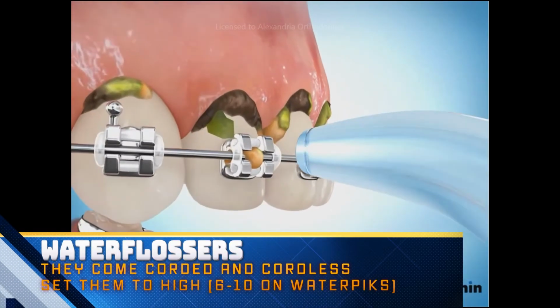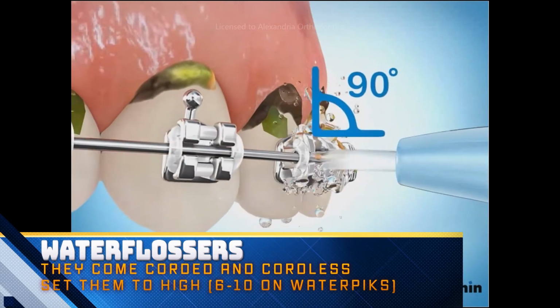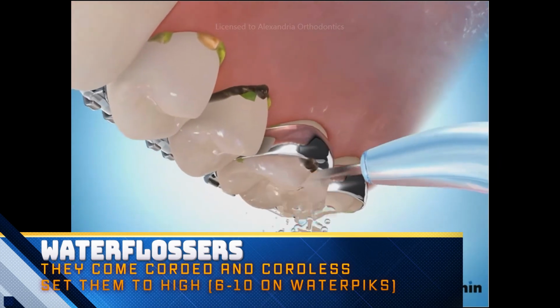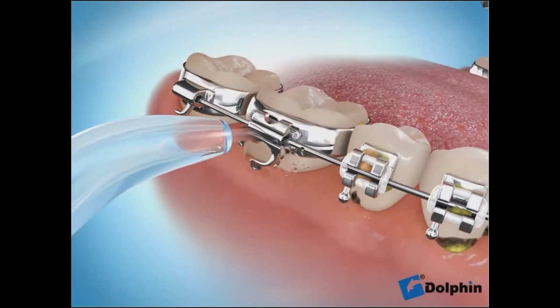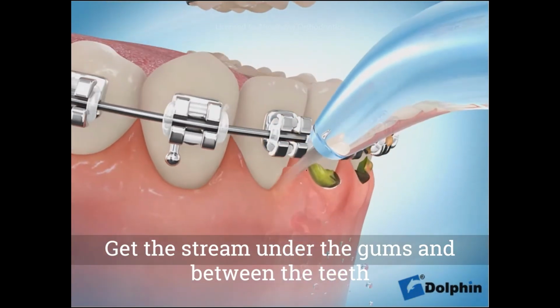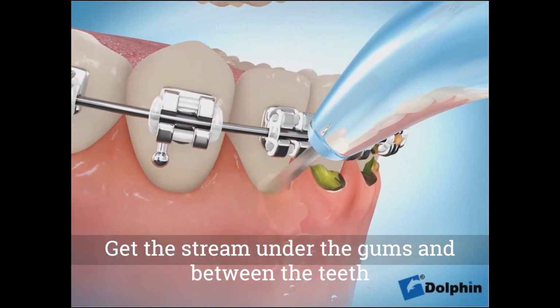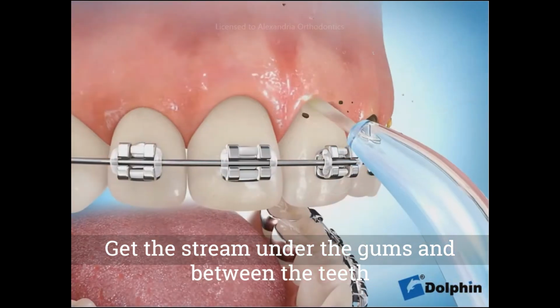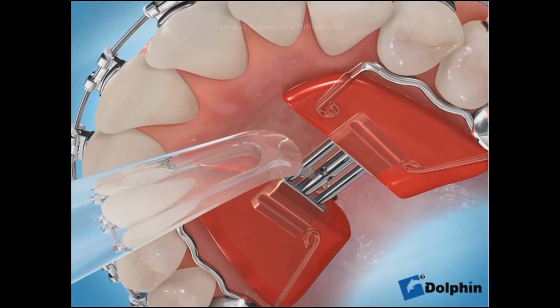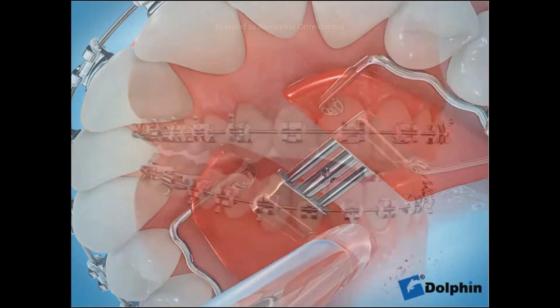Water flossers can be corded or cordless. The key is to use the high power setting. On corded devices, set the water pressure between 6 to 10 to get adequate water pressure to remove plaque in between the teeth. While you are using the device, lean facing over the sink and wrap the lips around the tip while allowing the water to drain. They are also very effective in cleaning under appliances such as expanders.